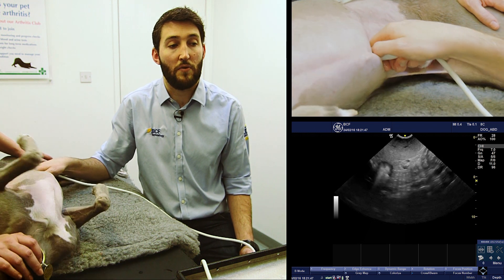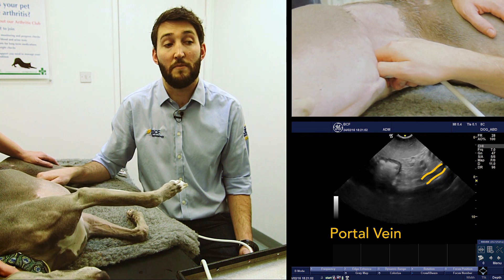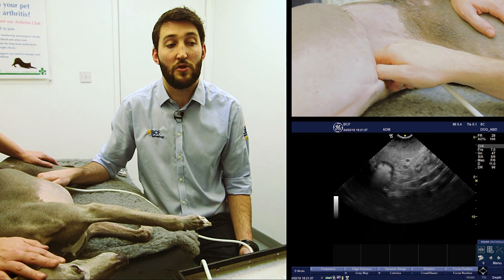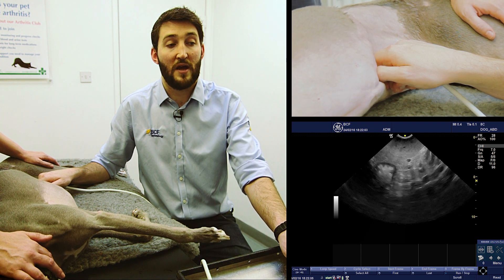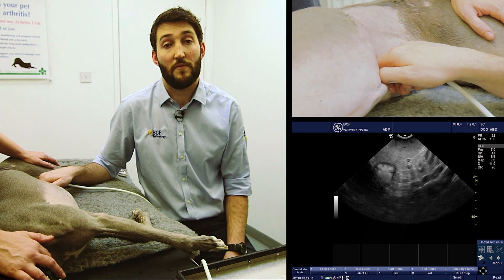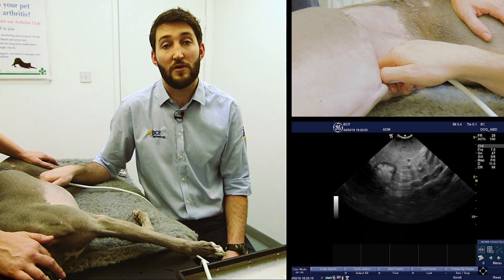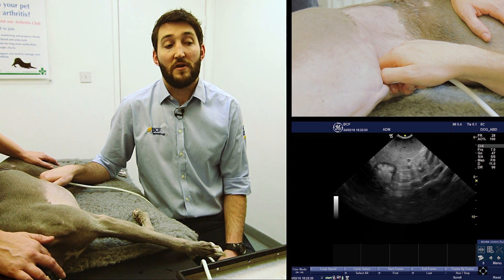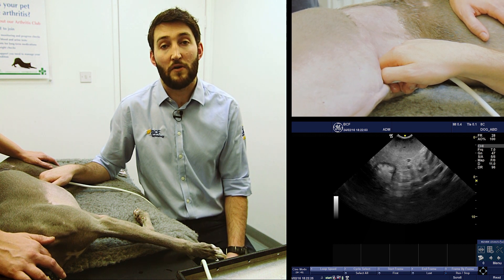We're looking for the appearance of the portal vein. As I come up very very slowly, watching the screen — just there — we can see at the bottom of the screen the portal vein appearing in the image. At that point, where we have the portal vein in the image and the stomach in the image, if I freeze the screen we can now see what we're going to do: look at about four o'clock on the stomach — down and to the right on the screen.